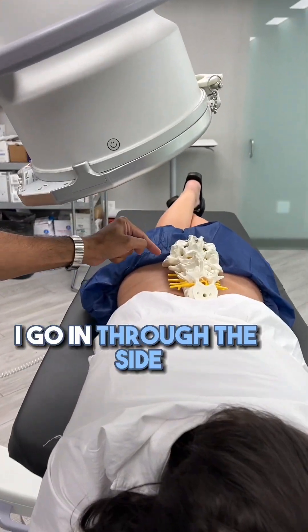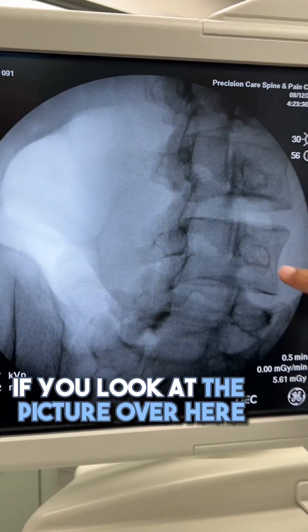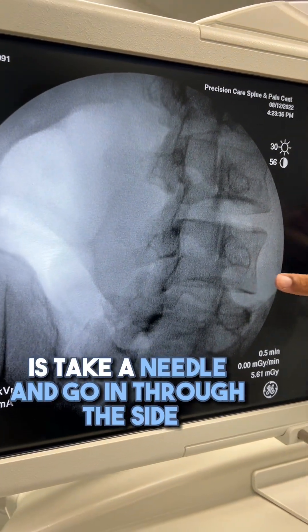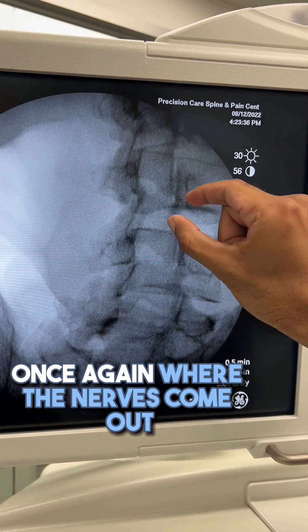I take a needle and go in through the side. If you look at the picture over here, what I would do is take a needle and go in through the side once again, where the nerves come out.